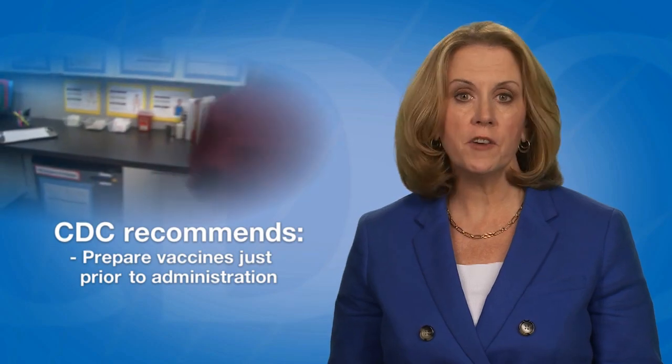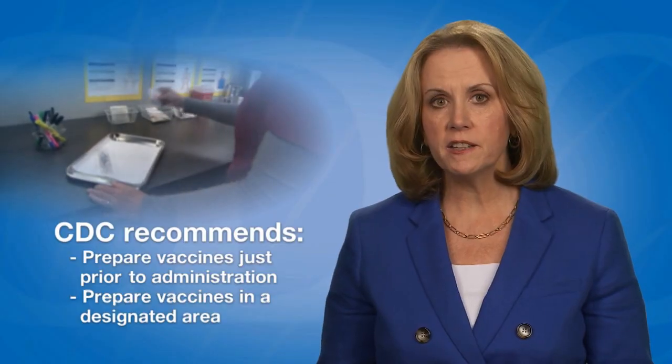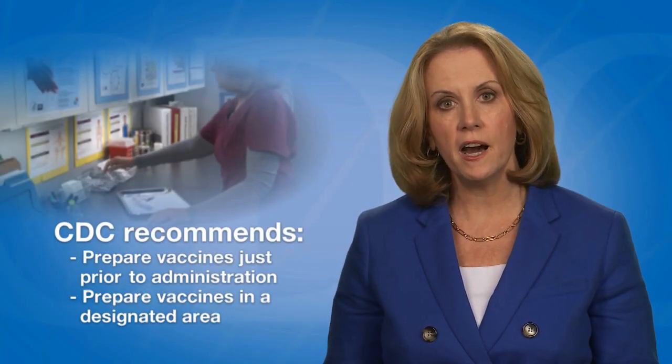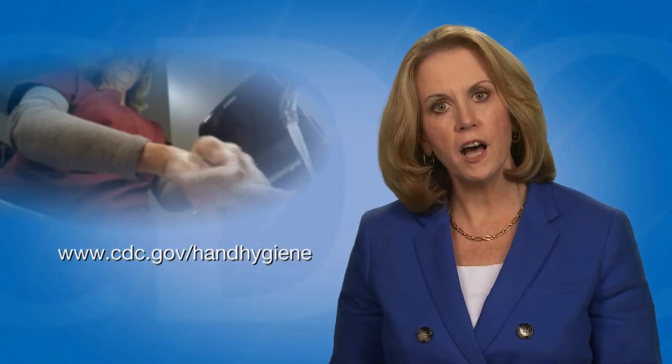Steps include gathering necessary supplies and selecting an appropriate syringe and needle. CDC recommends providers prepare vaccines just prior to administration. Providers should prepare vaccines in a designated area that is not adjacent to any area where potentially contaminated items are placed. Before preparing or administering any vaccine, always start with proper hand hygiene. CDC has hand hygiene guidelines and resources for healthcare personnel available online.